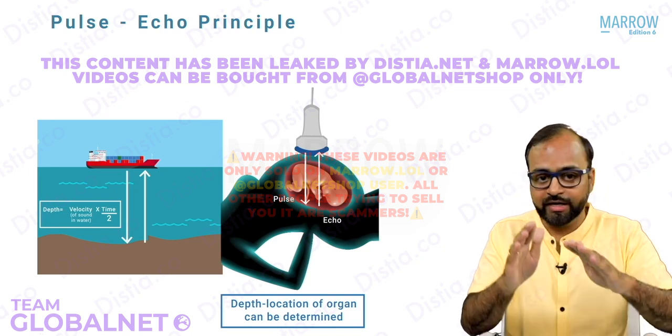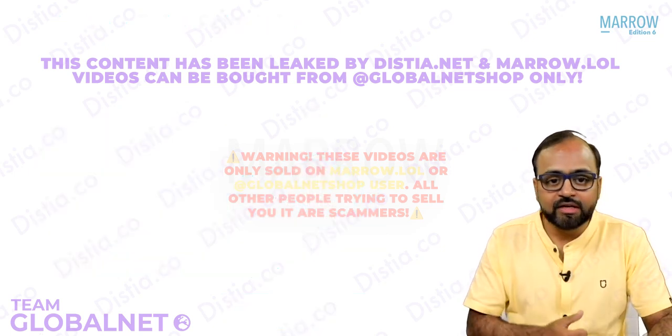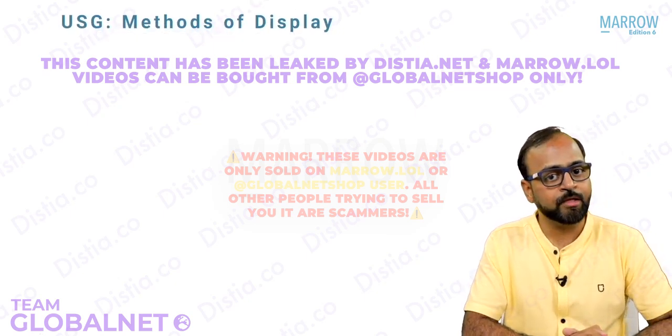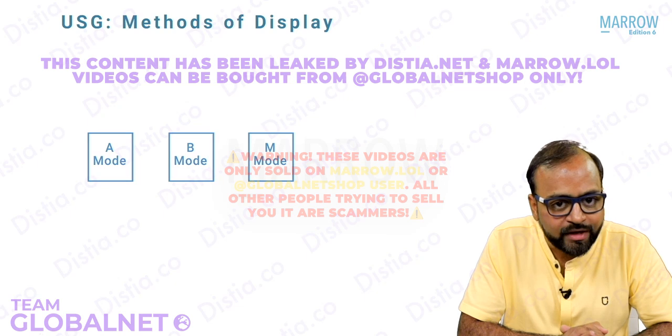Now I know I can measure the depth of a particular organ from the skin surface, but how do I create the ultrasound image, right? For that, we will now discuss what are called the methods of display of ultrasound. There are 3 methods of display: A mode, B mode and M mode. What are these methods of display? Let us quickly have a look.